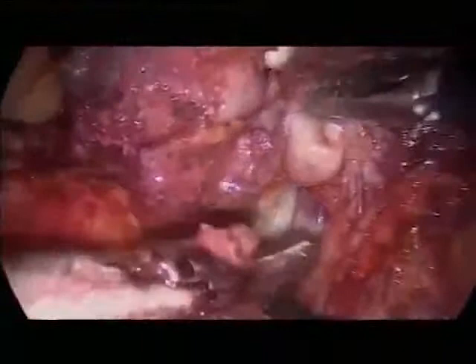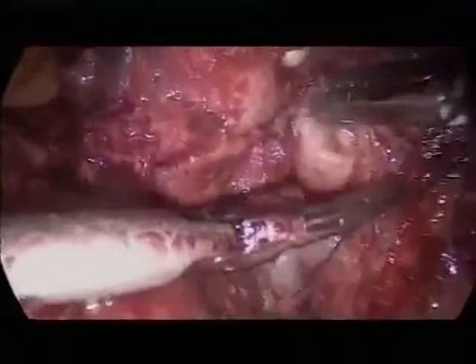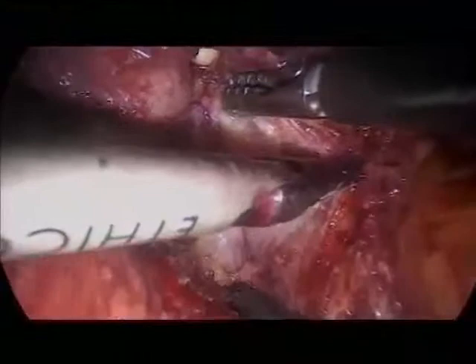And the next step is we mobilize the vas. It's always good when you cut the vas a little bit longer. That's why we try to mobilize a little bit, because then the access to the tips of the seminals is easier.